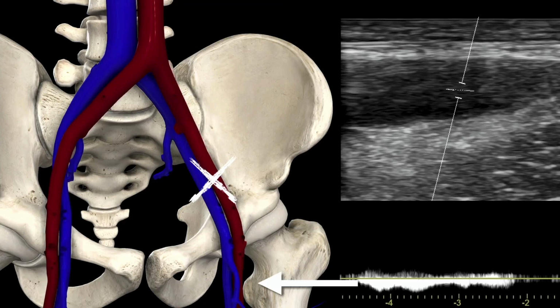And even compare that to the other side and see if it's the same from one side to the other. The theory behind it is, if you have a unilateral obstruction to flow, you can see a blunting of that venous waveform, either compared to the other side or just a blunting altogether, as it relies on collateralization to get things back.